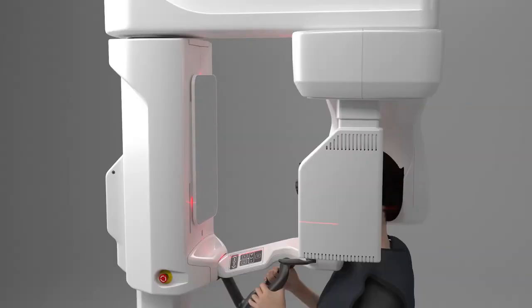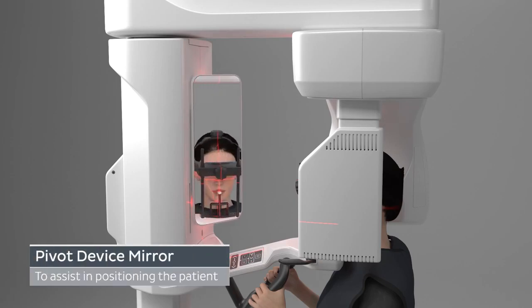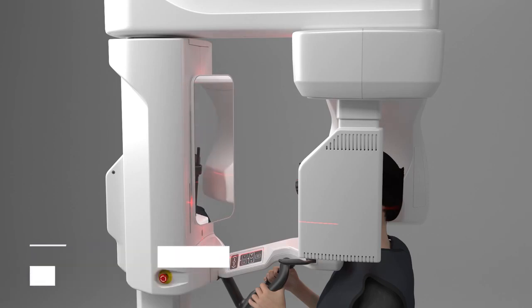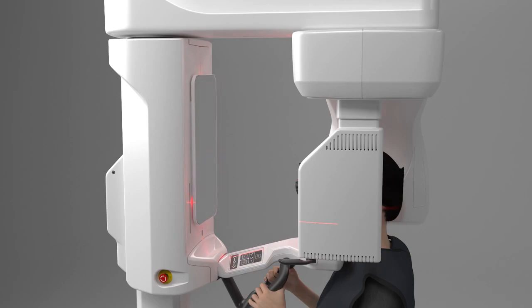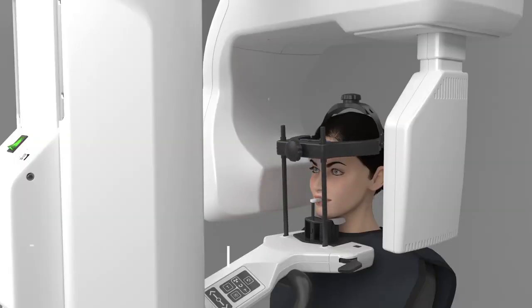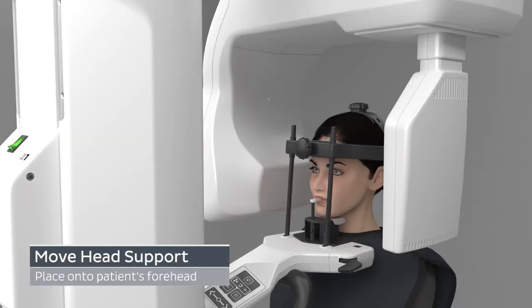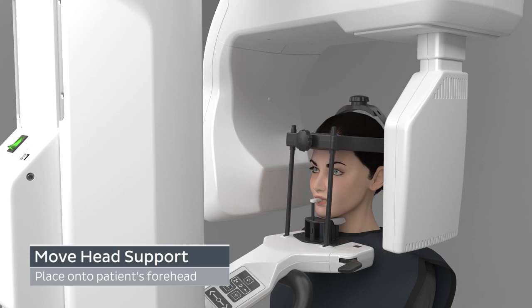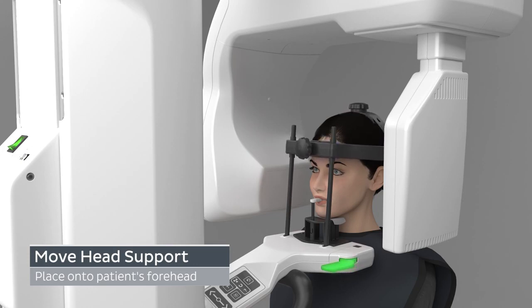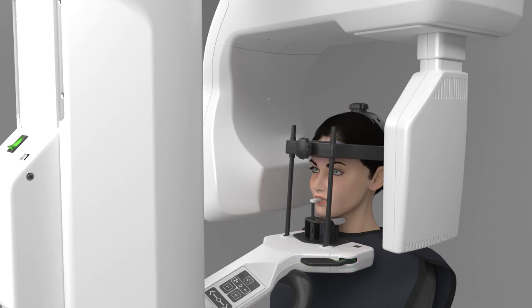You can open the mirror and use it to assist in positioning the patient. Close the mirror before you start acquiring an image. Move the head support against the patient's forehead and adjust the height if needed. When complete, lock the head support using the locking lever.